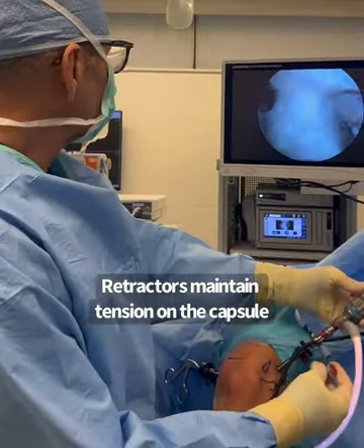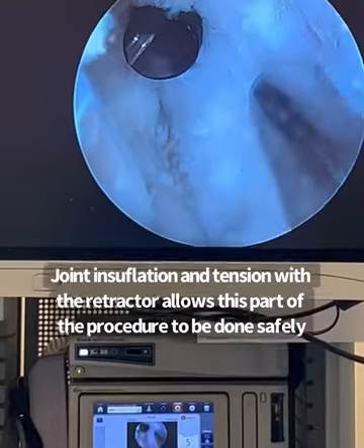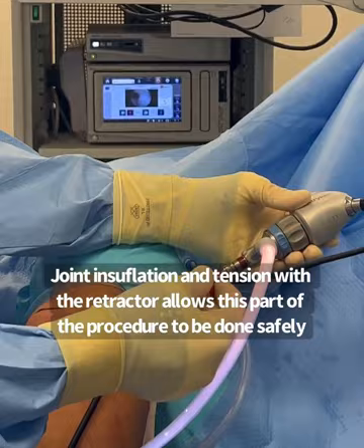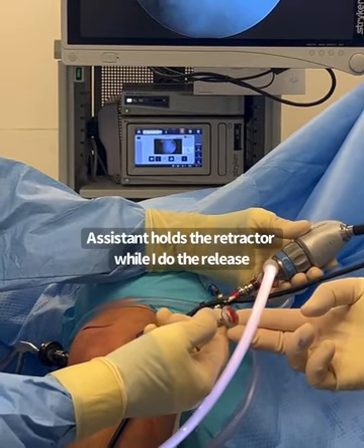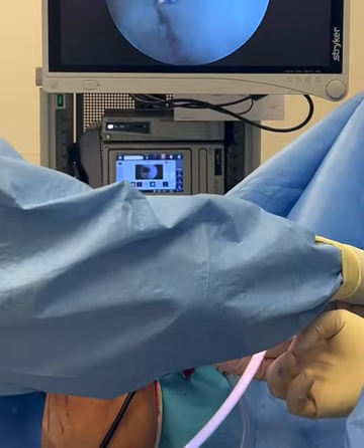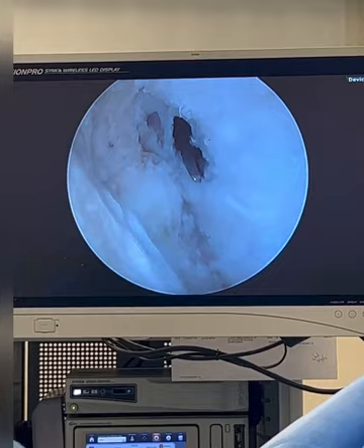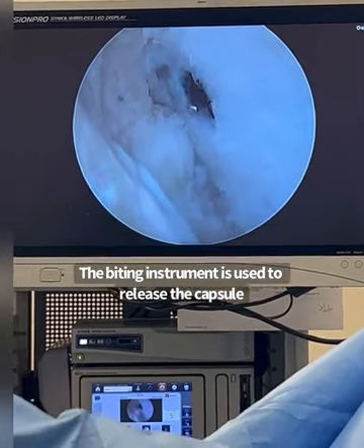That's why we do the capsule release last. The trick is that you have to have a retractor. What I have right here is an obturator — I use it to put a little stretch on the capsule. I'm putting a little stretch on the capsule and looking over there as it becomes taut, then I have my assistant gently hold it. On the other side I have a biter instrument, gently massaging the tissue away from the white capsule. You can use a basket biter like I am, or a capsule punch specifically made for this.